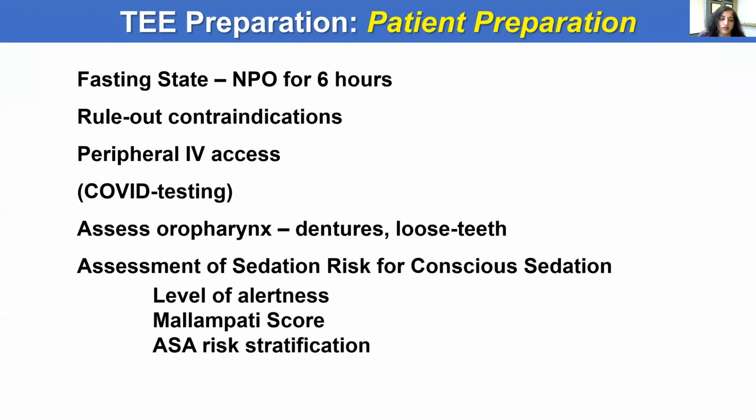Now in this day and age, pre-procedure COVID testing can be of value in certain institutions. You want to assess the oropharynx, so any denture should be removed. Any loose teeth should be documented and watched. Then you want to assess the patient for their overall appropriateness for conscious sedation.